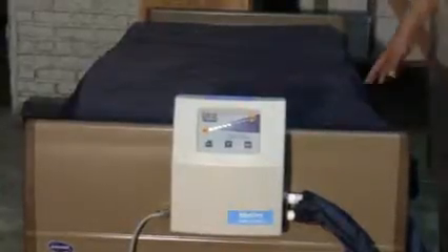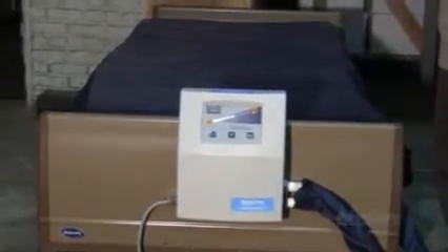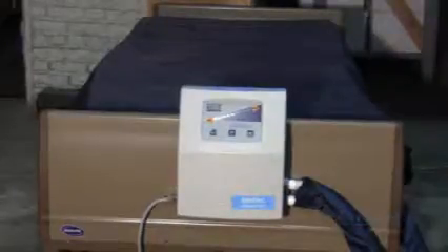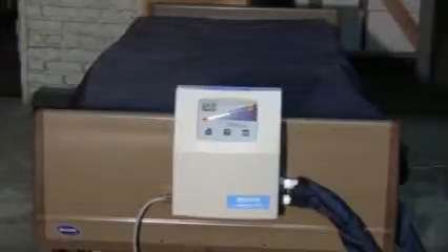If your top sheet gets soiled for any reason, you may clean it with a mild soap and water solution. Spray the top sheet down, wipe it with a damp cloth, and dry it with a dry cloth. Do not place any linens on until it is completely dry. Please do not use any bleach or ammonia on the top sheet.